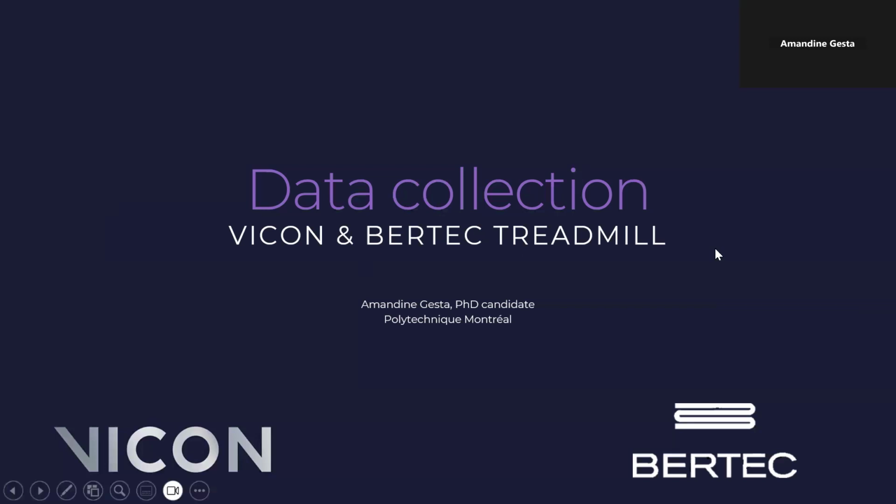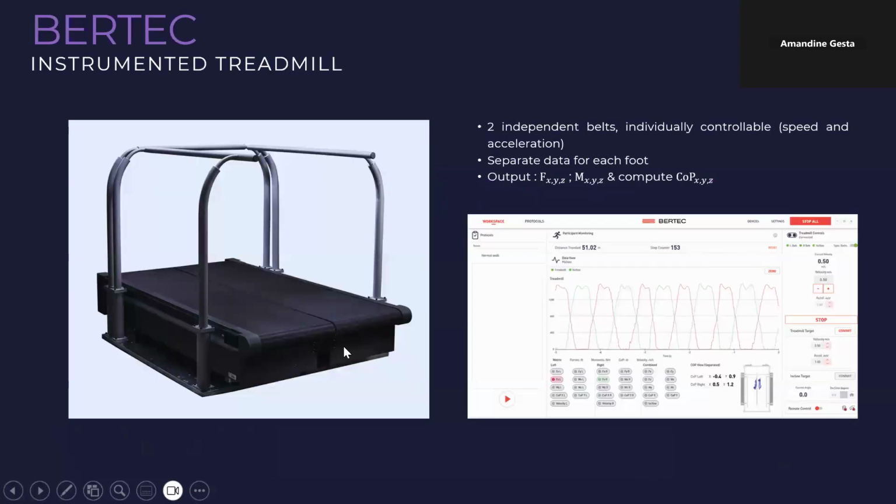The Bertec treadmill looks like this. We have a double split-belt treadmill with two force plates. The data recorded are completely separate, so we have data for one foot and for the other one. They are not linked, so we don't have crosstalk. We can control the speed and the acceleration of the belt individually. The output is the force, the moments, and it also computes the center of pressure trajectory for each foot.